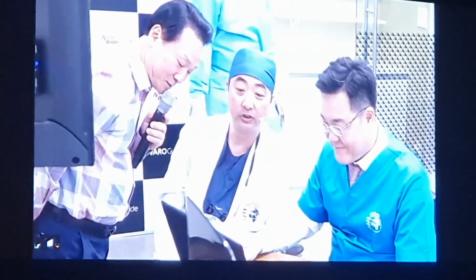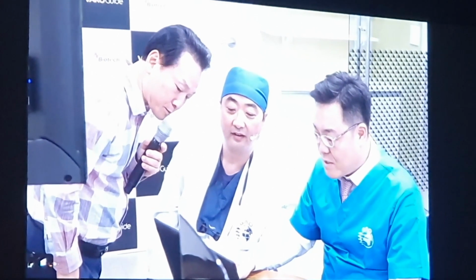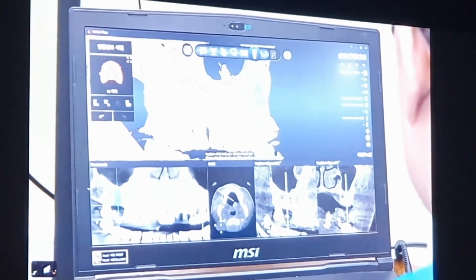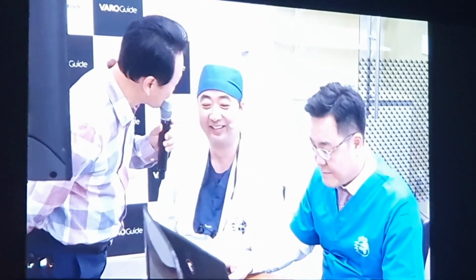What's the size of the implant? Not bad at all. Looks like a pretty simple case. So medial distal width is a bit narrow, so what about using 4.5 diameter and 10 mm fixture? I want 5 in diameter, please.